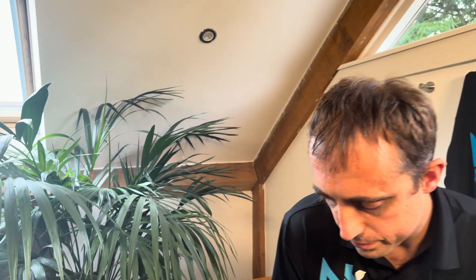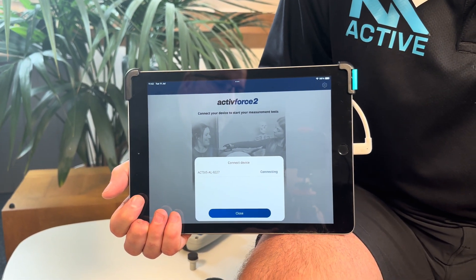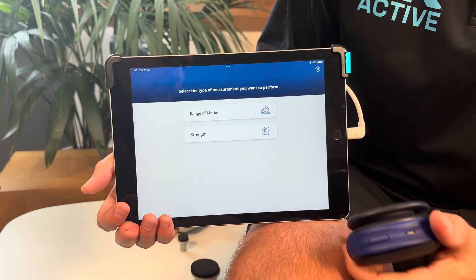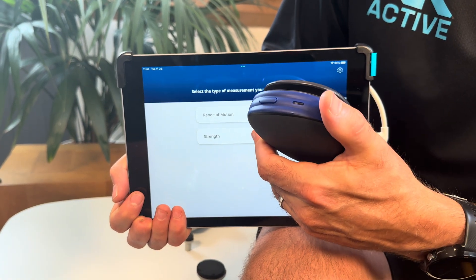It doesn't have a screen or anything on it — we have to attach it to our iPad, iPhone, or other tablet. Let's turn it on. It's now searching and connecting — there we go, it's found my dynamometer. With this, you can measure range of motion and you can measure strength.